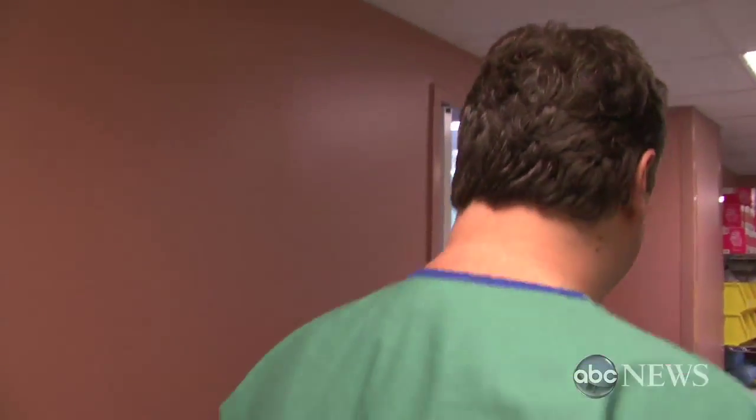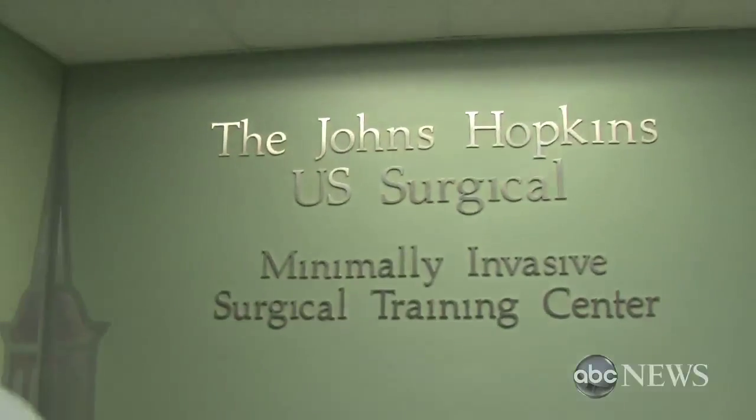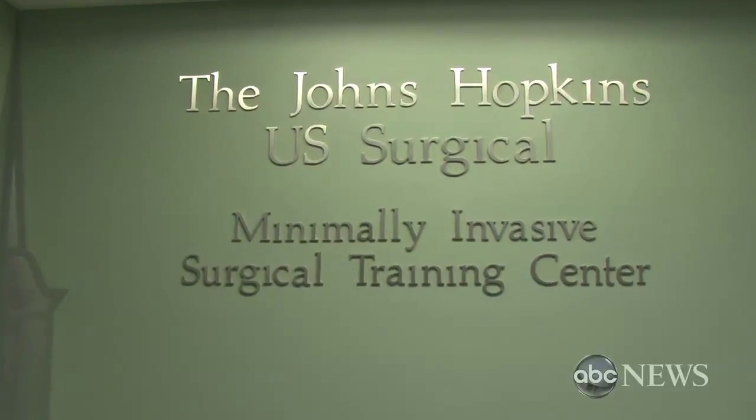I'm training Joe DeSimone, one of our chief residents here at Johns Hopkins. The majority of what I'm going to do is heart failure surgery — patients with quite sick hearts — and learning minimally invasive technique for this is probably the best way to do it.